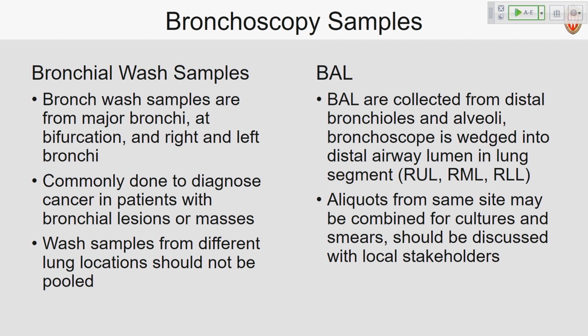But really, the guidance is, if you're going to do something like that, you want to take it up with local stakeholders. Infectious disease is a big stakeholder, pulmonary is a big stakeholder, so have that conversation with them and understand whether they are open to us pooling those samples or keeping them separate.